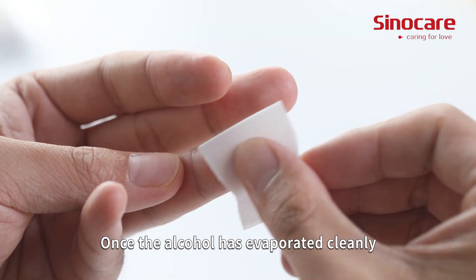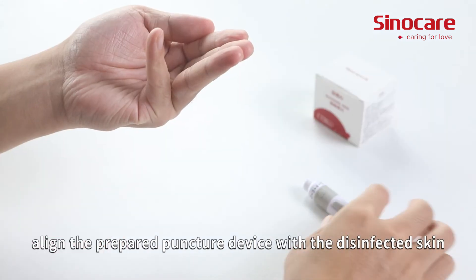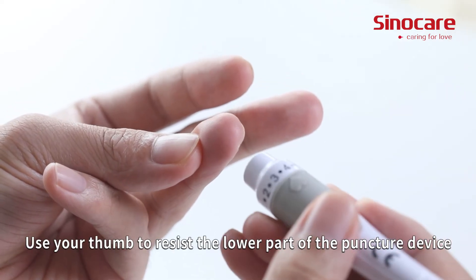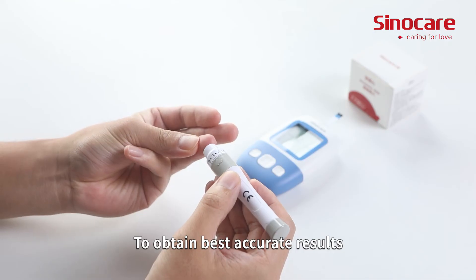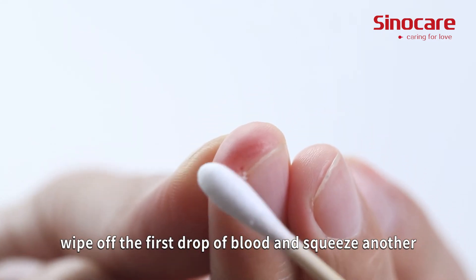Once the alcohol has evaporated cleanly, align the prepared puncture device with the disinfected skin and press the button to collect the blood. Use your thumb to resist the lower part of the puncture device to help the blood draw. To obtain the best accurate results, wipe off the first drop of blood and squeeze another.